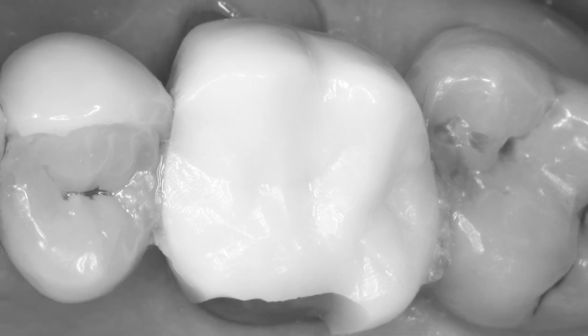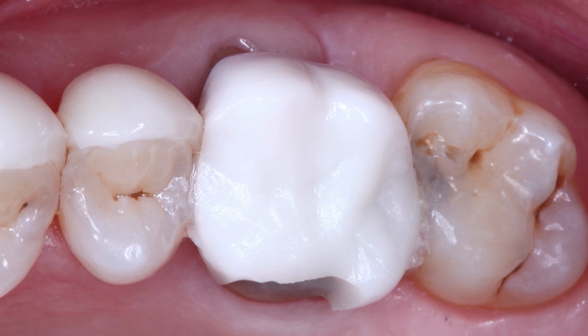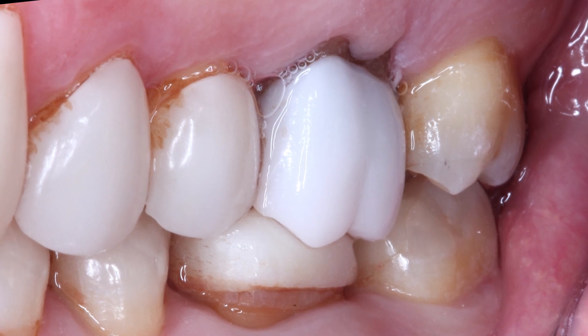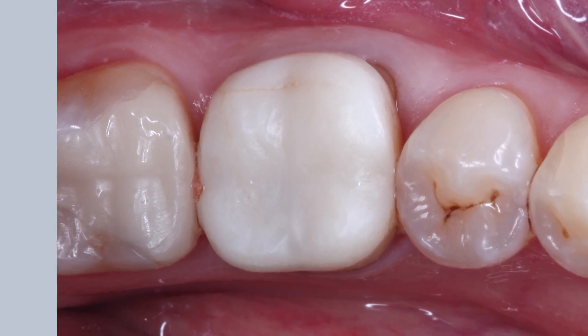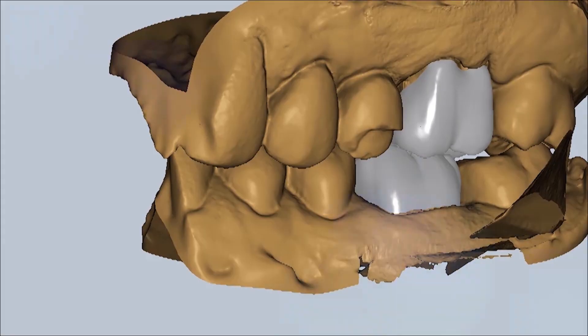We have a 50-year-old male that presents with a fractured Emax crown on his upper left first molar, number 14, that also appears to have super-erupted, most likely from the low occlusal position of the crown on the lower left first molar, number 19. We plan to replace both with Bruxer Now crowns milled chair side using the Glidewell in-office solution.